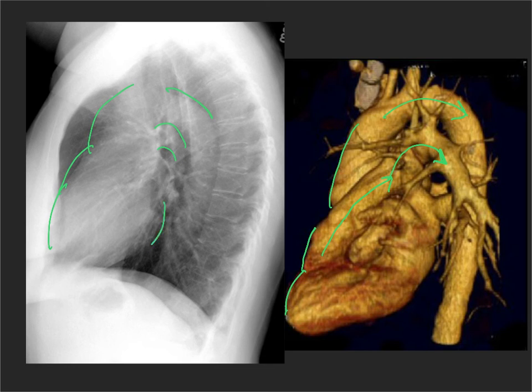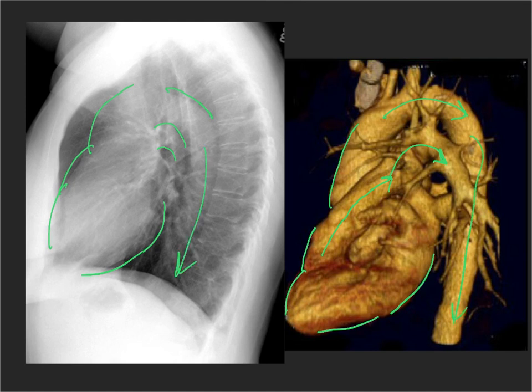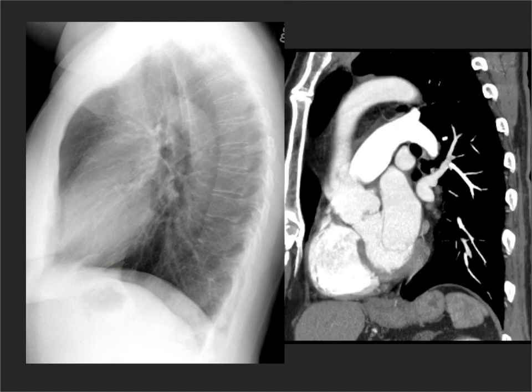On the CT, here is the left atrium, here is the left ventricle, and then obviously we have the aorta coming all the way down.